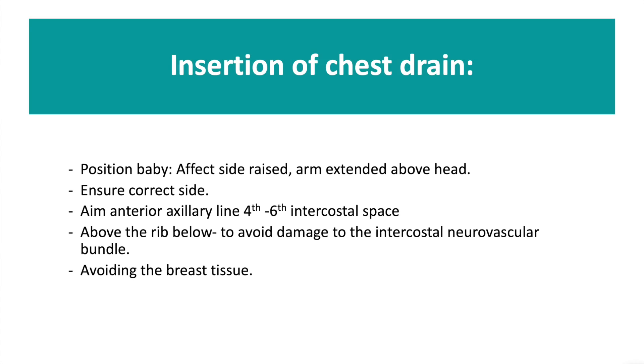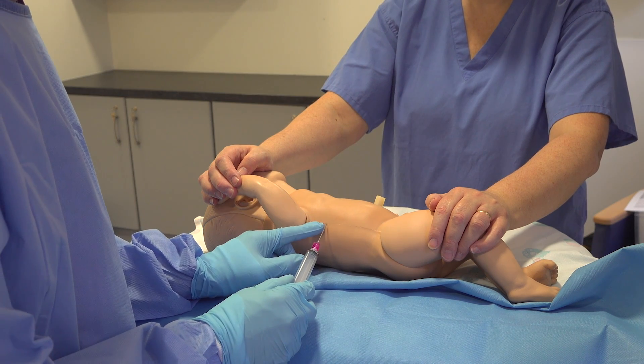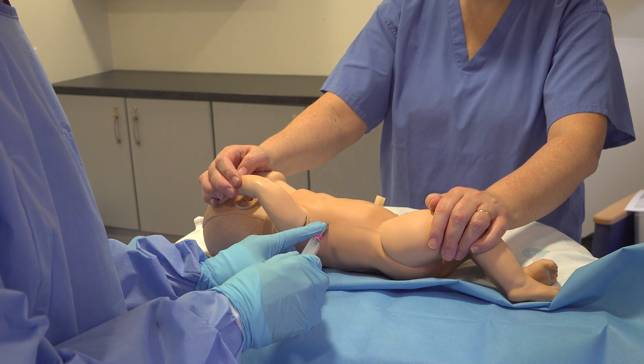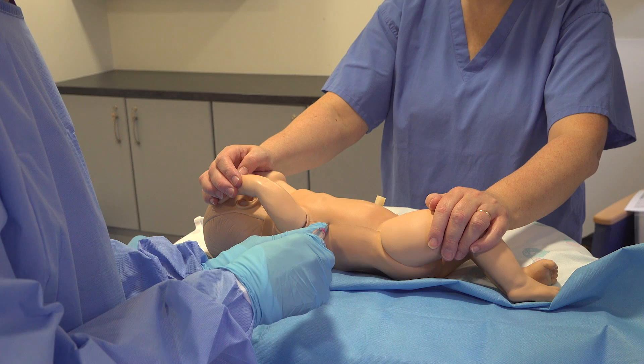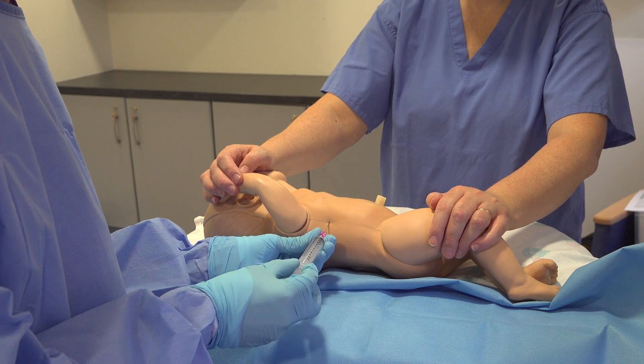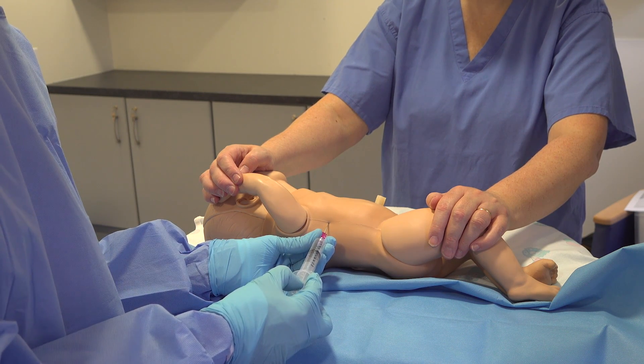We've already injected our local anaesthetic and cleaned the area. You're going to go in above the rib below, through the intercostal muscles into the pleural space, withdrawing as you go until you hit the air pocket, and you'll feel air nicely coming back.